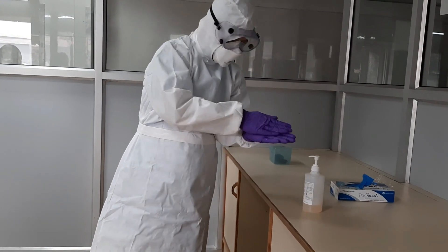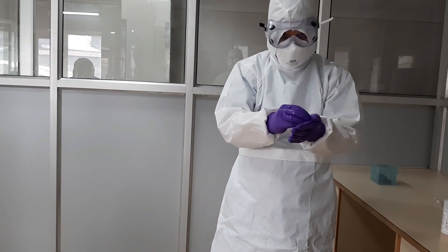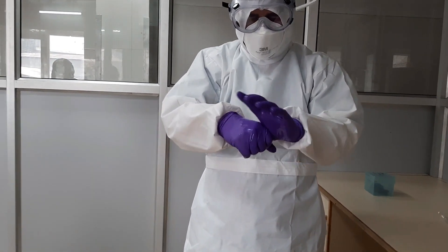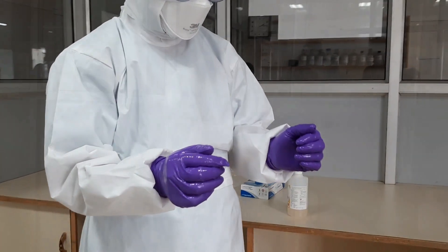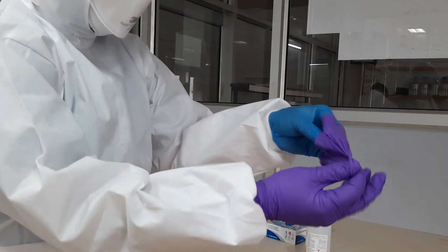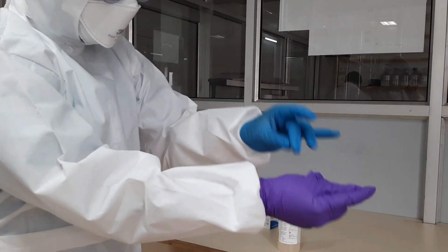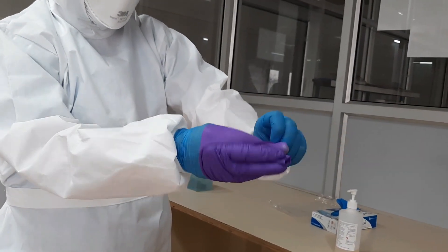Perform hand hygiene. Remove outer gloves, ensuring not to tear the inner layer of gloves. Do not snap the gloves, as this could cause spray. Pinch one glove and lift around the wrist, rolling it into a ball. Similarly, repeat on the other hand, covering the previous gloves.